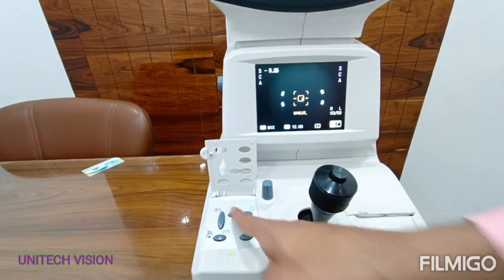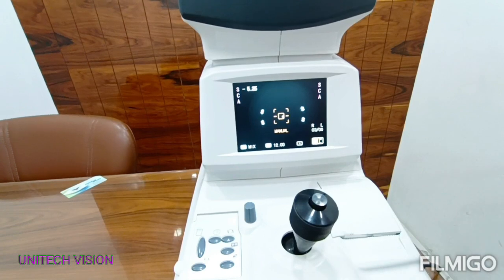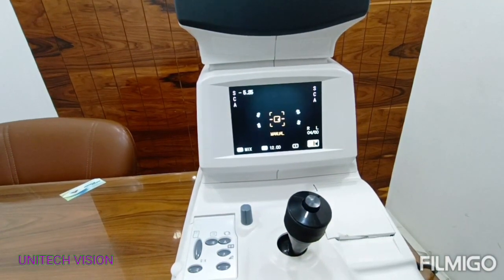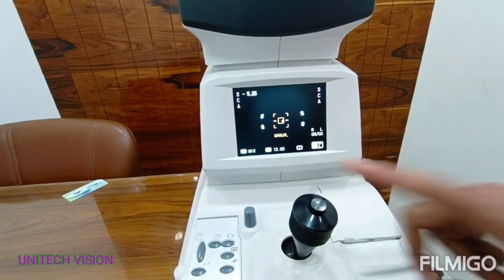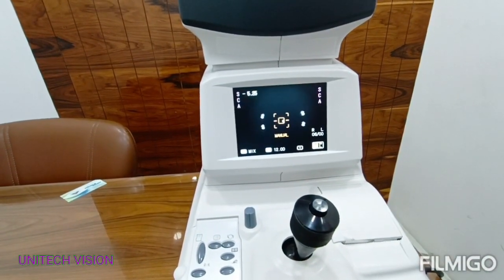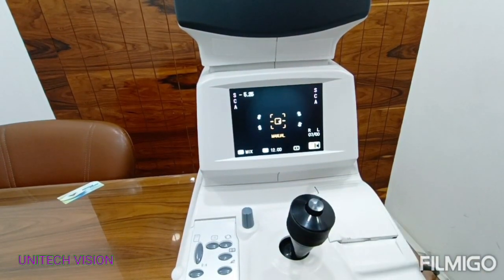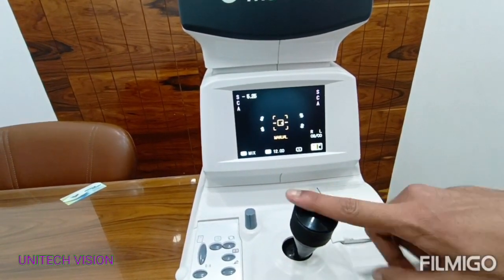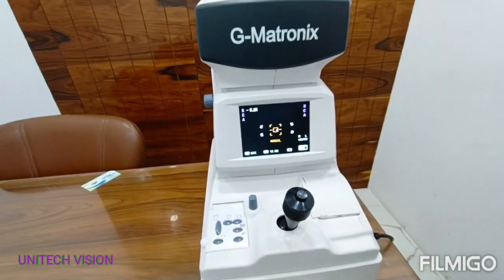Now manual mode. Readings 4, 5, 6, 7, 8, 9 — reading is complete in manual mode.